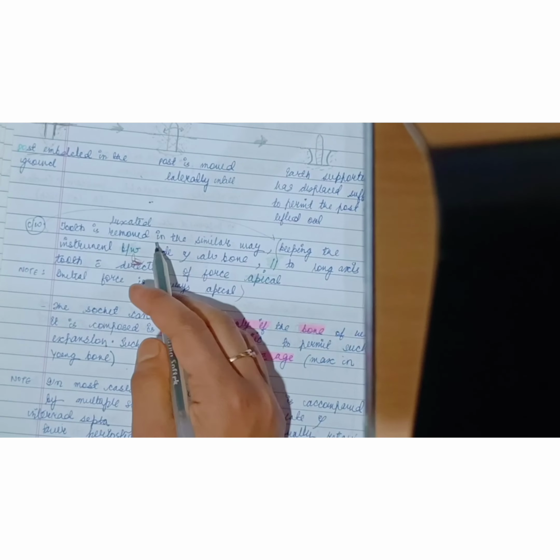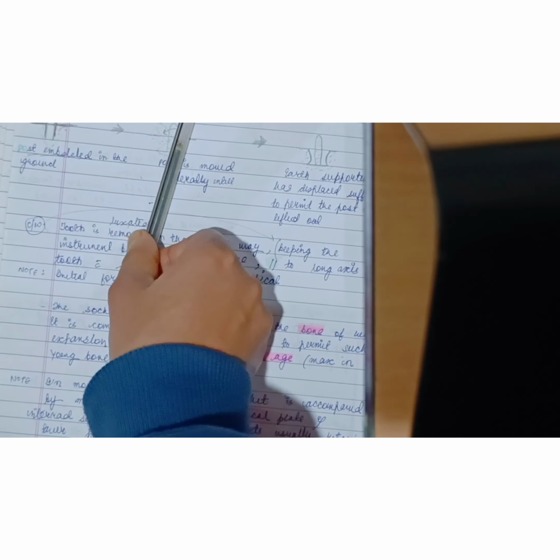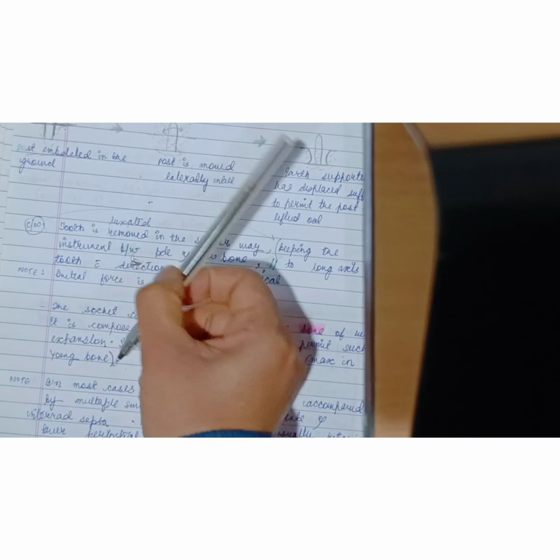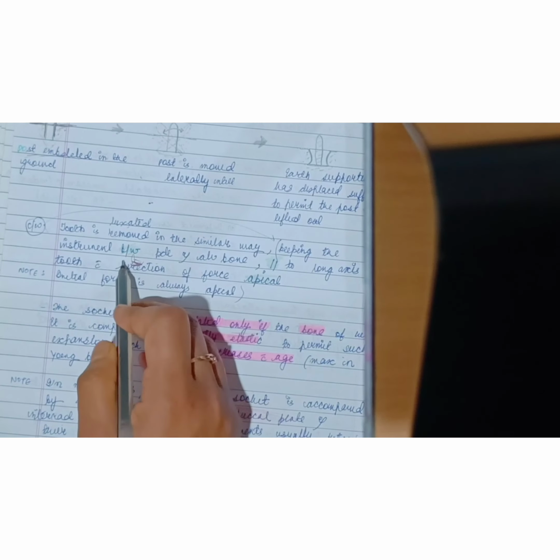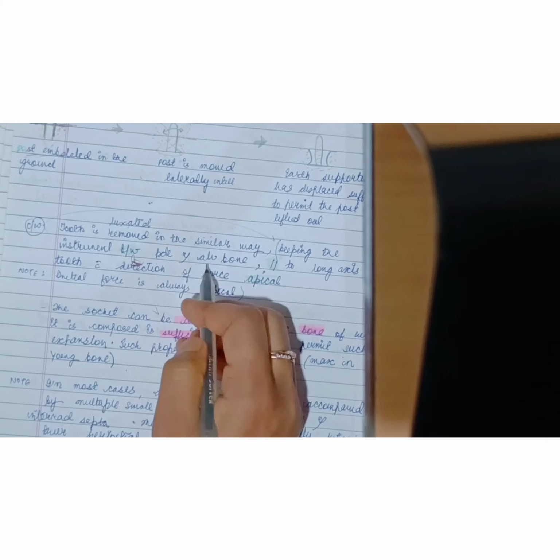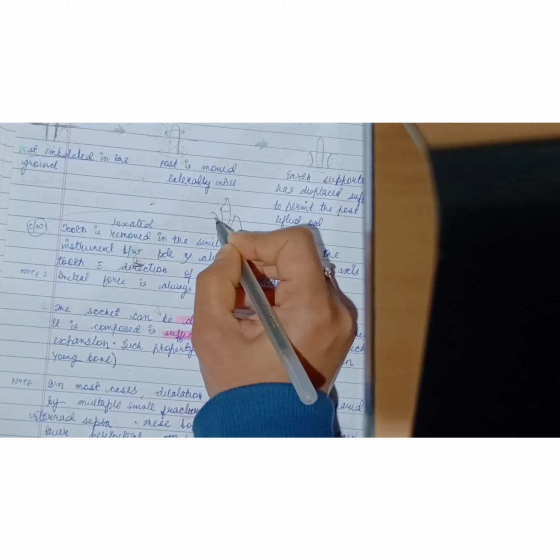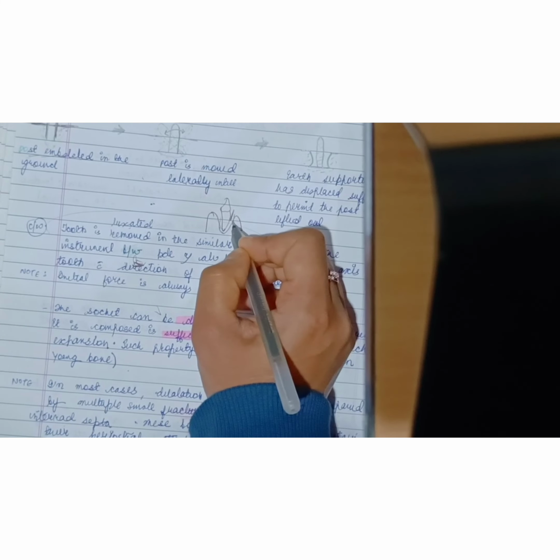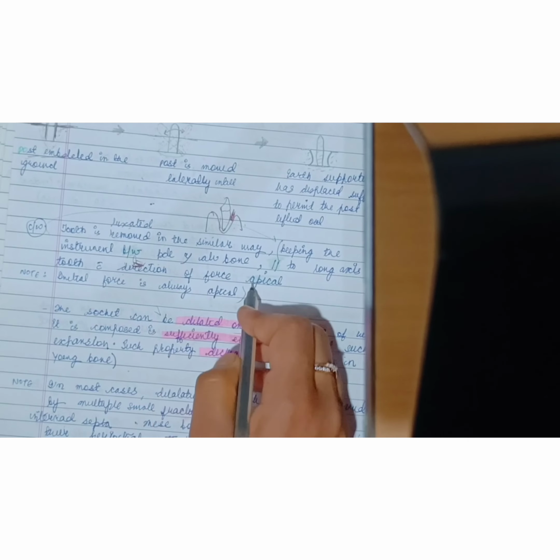So the tooth is removed in a similar way. Like the post which was embedded in the ground, we dilated the ground by using the post as a dilating instrument. Similarly, the tooth is luxated in the same way, keeping the instrument between the PDL and alveolar bone. This is the tooth, this is the alveolar bone, this is the periodontal ligament space. We will keep the instrument here between the PDL and the alveolar bone, parallel to the long axis of the tooth with the direction of the force apical.